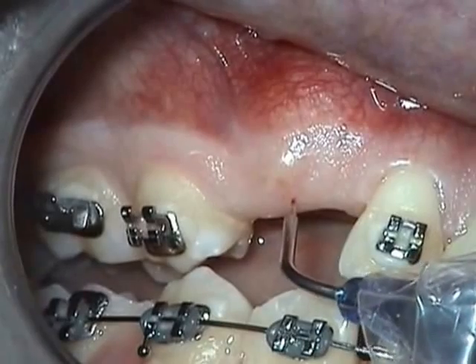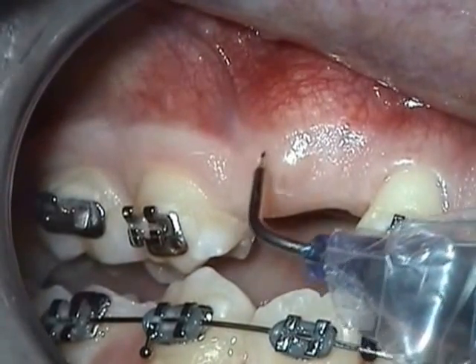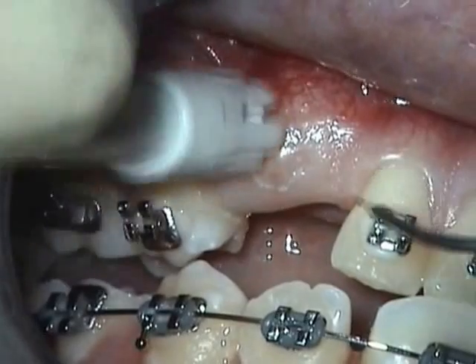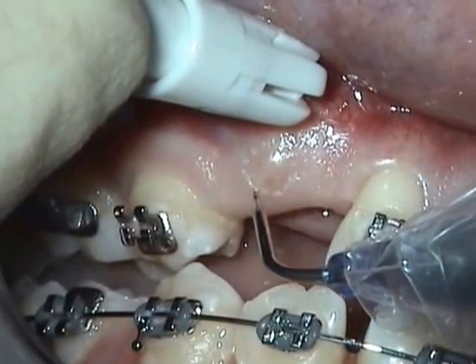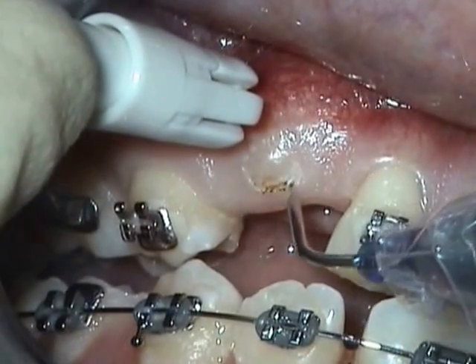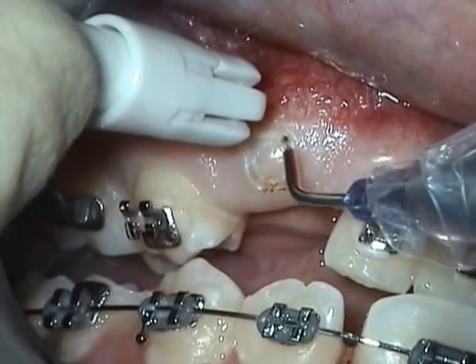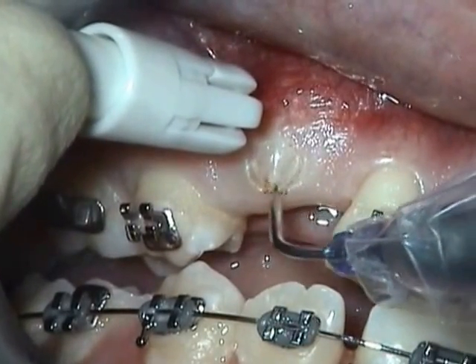Ensure that your tip is well initiated and start at the tip of the tooth, working your way in sweeping motions of about 2 mm wide. Gently start to excise the tissue. Continue until you actually touch the tooth, then carry on along the circumference of the margin of the tissue to be excised.